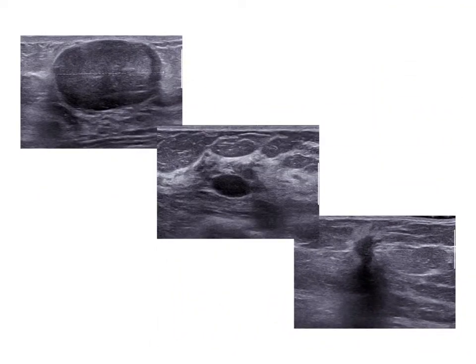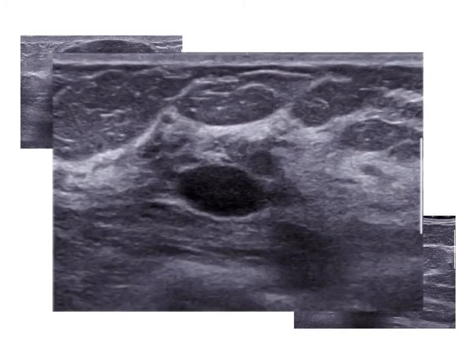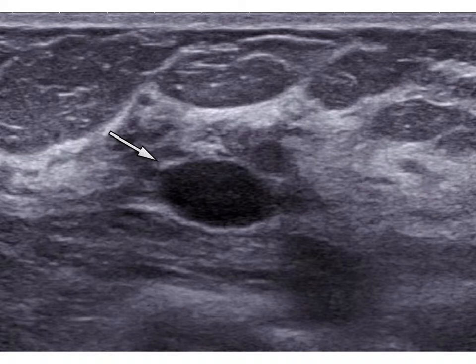Finally, look at the tumor in the middle. It looks very benign, but in fact it is a cancer. It is a fast-growing or high-grade tumor of the kind that are often seen in high-risk women. You can see a capsule. There is edge shadowing and posterior enhancement.